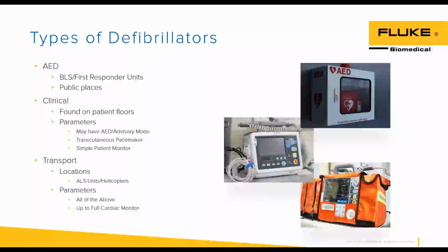And then we have transports, which are usually very compact devices that have all the modalities of patient testing. These are used, again, in non-clinical environments, maybe in a helicopter or an ambulance.